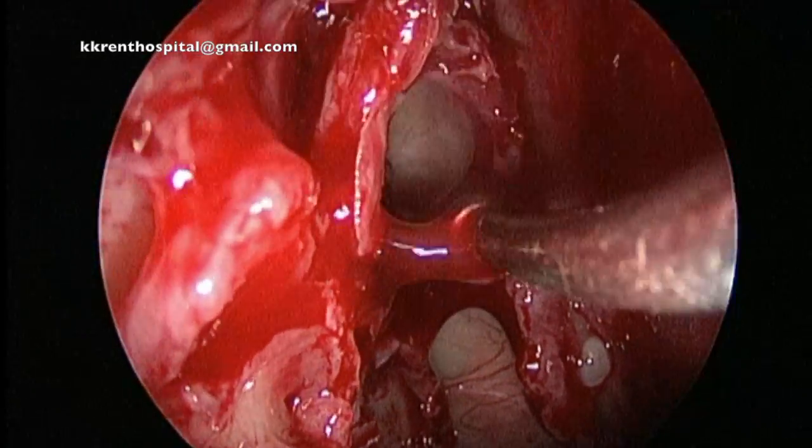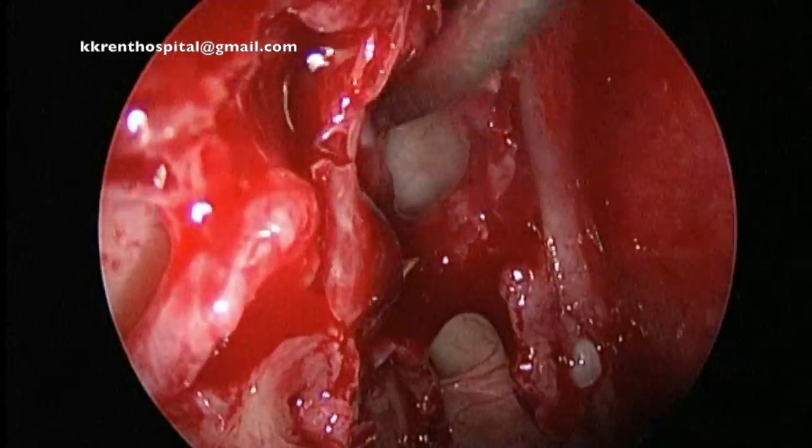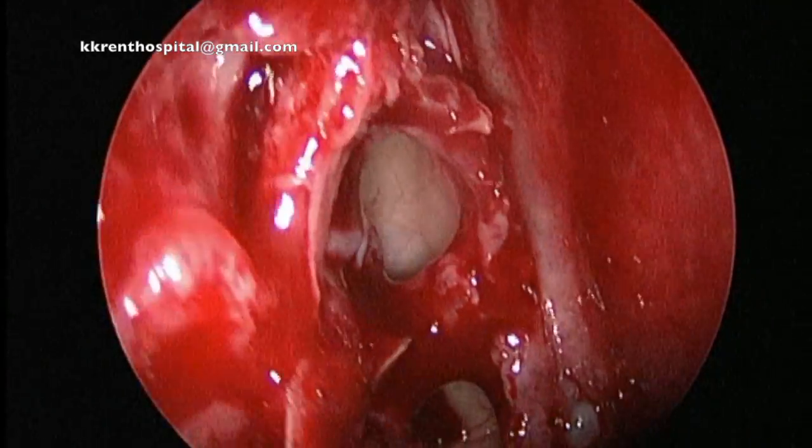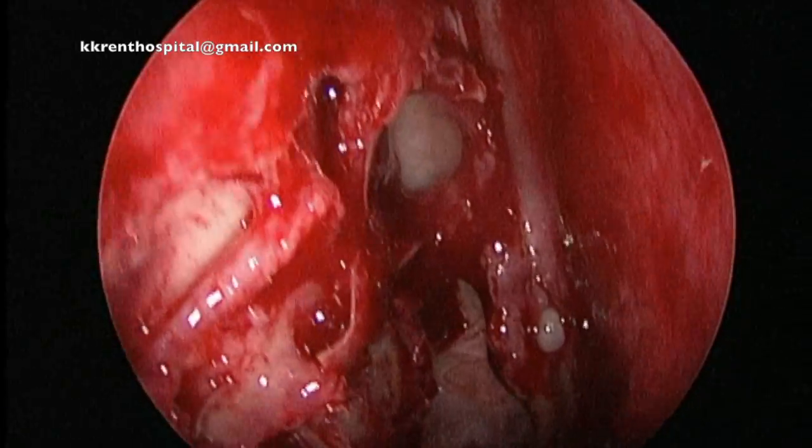The partition of the cell is being removed gradually, initially with blunt dissection, and you can see the ostium and the frontal sinus clearly demonstrated.